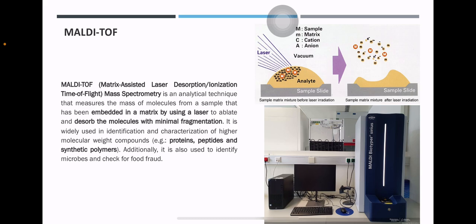The sample of your MALDI is uniformly mixed in a large quantity of matrix, and the matrix absorbs the ultraviolet light, usually with a wavelength of 337 to 355 nanometers, and converts it to heat energy. A small part of the matrix, down to 100 nanometers from the top outer surface of the analyte, heats rapidly in several nanoseconds and is vaporized together with the sample.